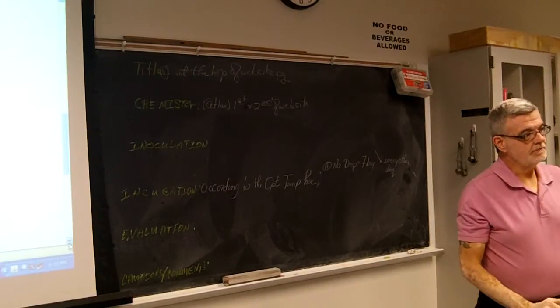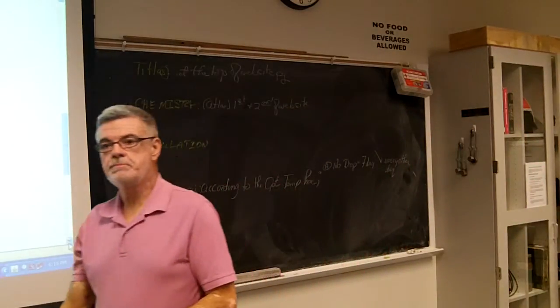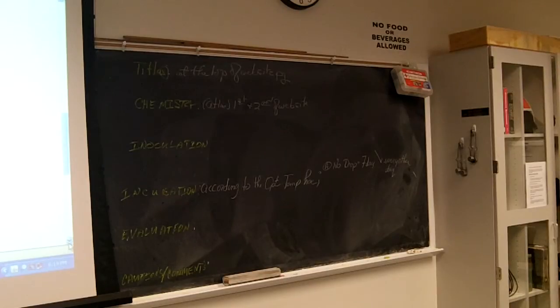So here's a test question. If your unknown has both, you don't have to add drops, but it does possibly turn gaseous if it's positive, how many options of answers do you have? All right, so you would have fast positive with gas, fast positive without gas, moderately fast positive with gas, moderately fast positive without gas, slow positive with gas, slow positive without gas, and negative. So there you have 7 options. Everybody see that?